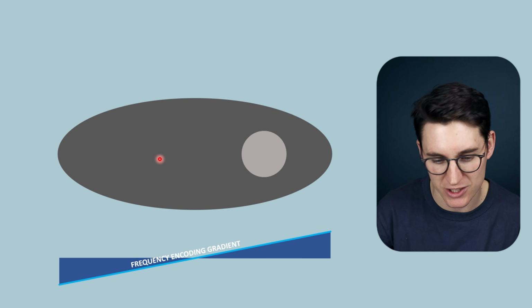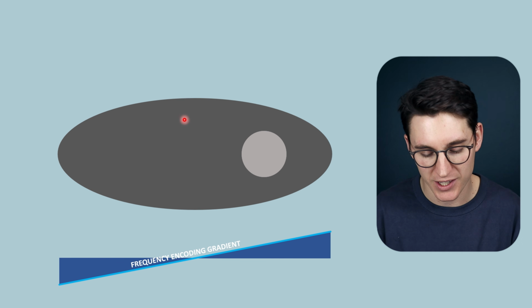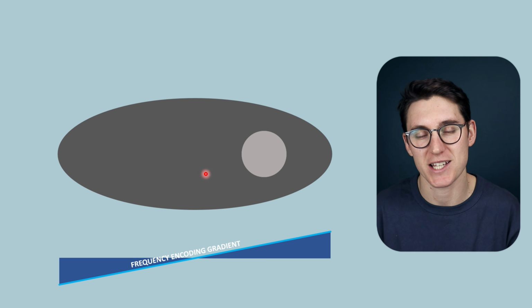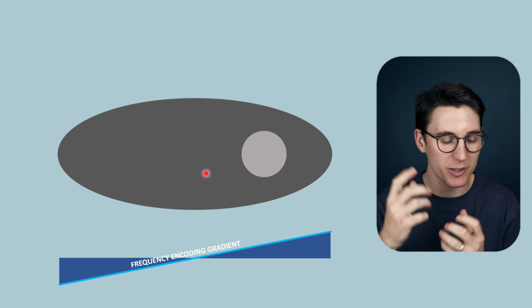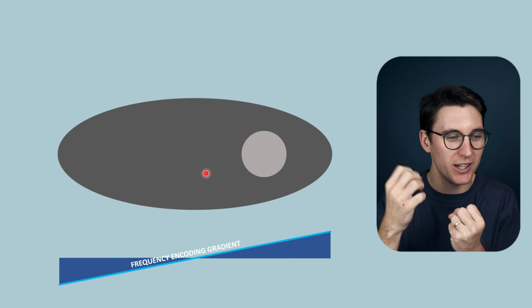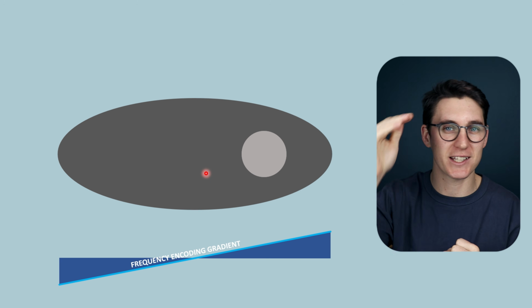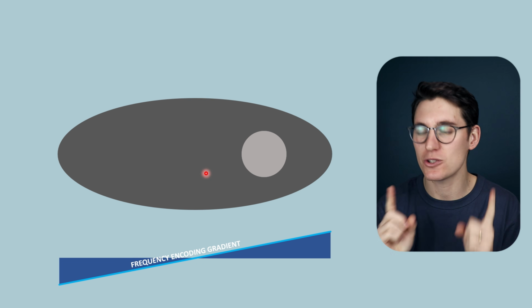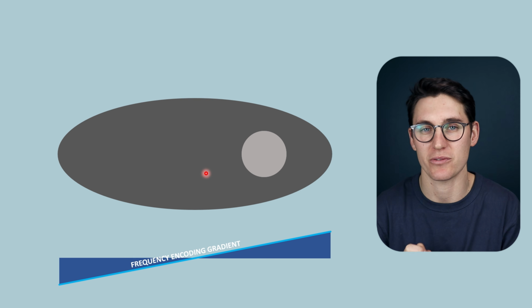If we have an image like this, the dark gray representing water, the light gray representing fat. Now the water is going to precess at a set frequency, and the fat is going to precess at a frequency that is slightly less than that of water. Now the machine itself has no way to know if the signal is coming from fat or from water. It can only tell the signal amplitude and the frequency at which that signal is coming from. That's the only 2 variables it has to plot this signal. We can't differentiate water and fat.